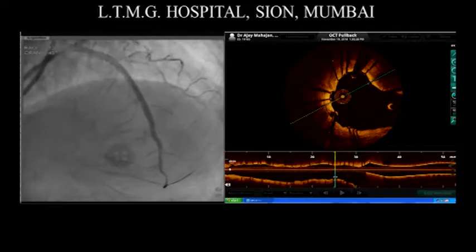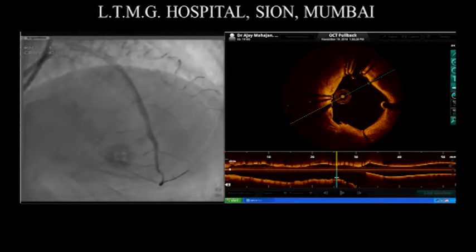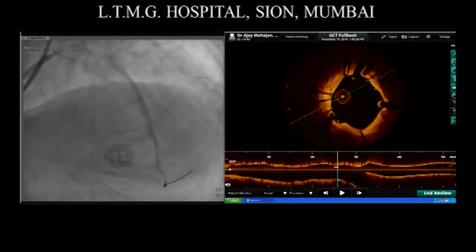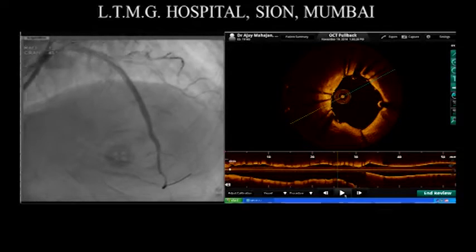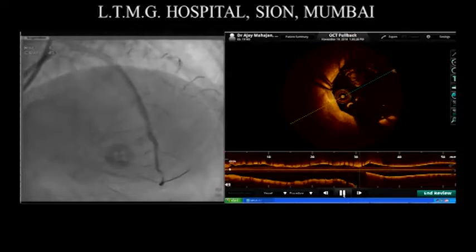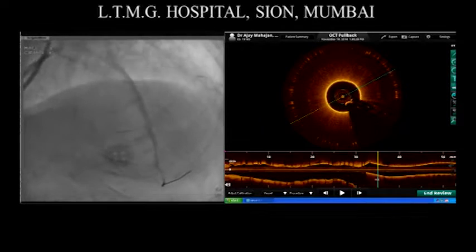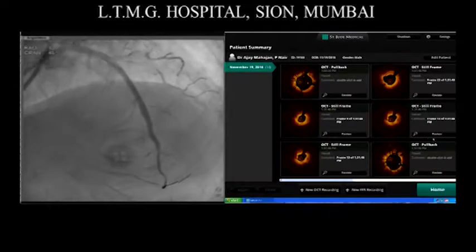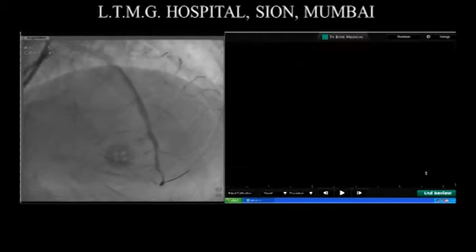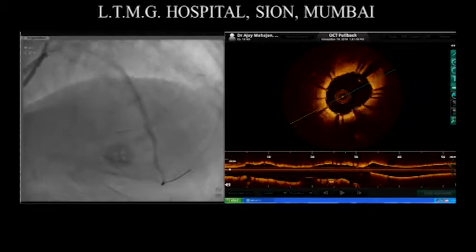Sir, cost here. Maybe you can just play it. This is left main. Yeah, play it there, please. Can you play it? From there, yeah. You could stop at the end of the stent or at the beginning of the stent, because I am wondering if this is already aorta or the stent is too small. So we should just evaluate this. We have to just see.